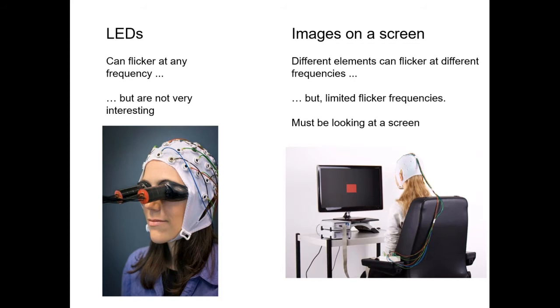Now, although many of us spend a lot of time sitting in front of a screen nowadays, this is not what our visual system evolved to do. The real world is far more interesting and important for truly understanding how the brain functions in everyday life. And for mobile EEG, of course, we don't want people just sitting in front of a screen. We want people moving around in the real world.